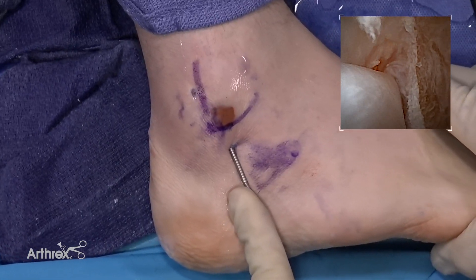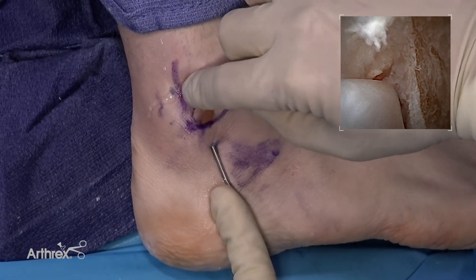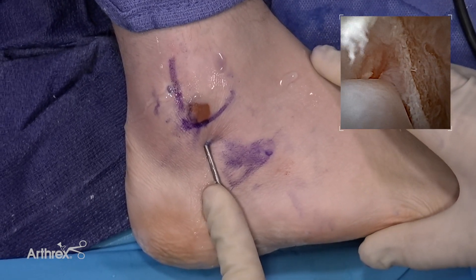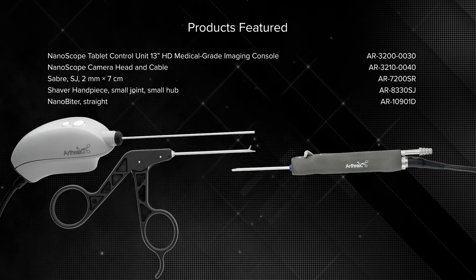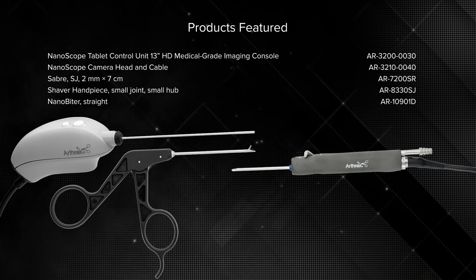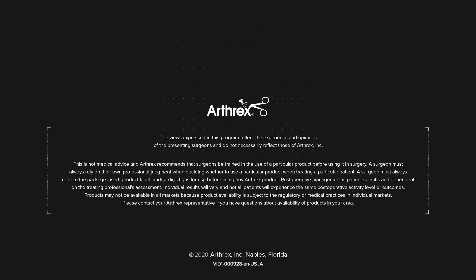Again, we maintain the integrity of the retinaculum on the top, so there is no subluxation or dislocation allowed at this stage. That looks great — it works well.